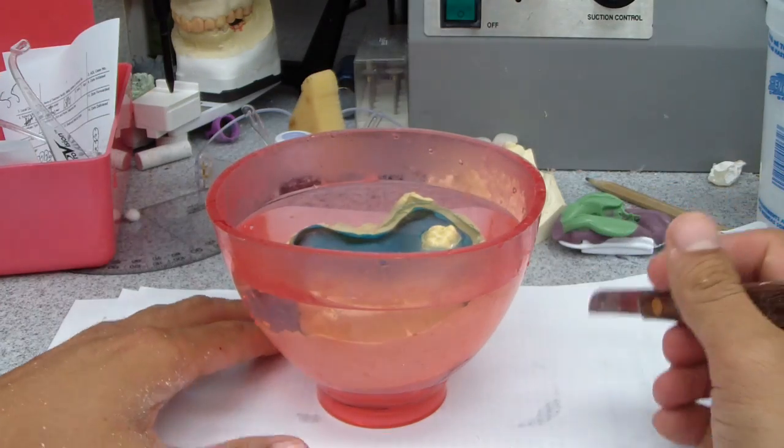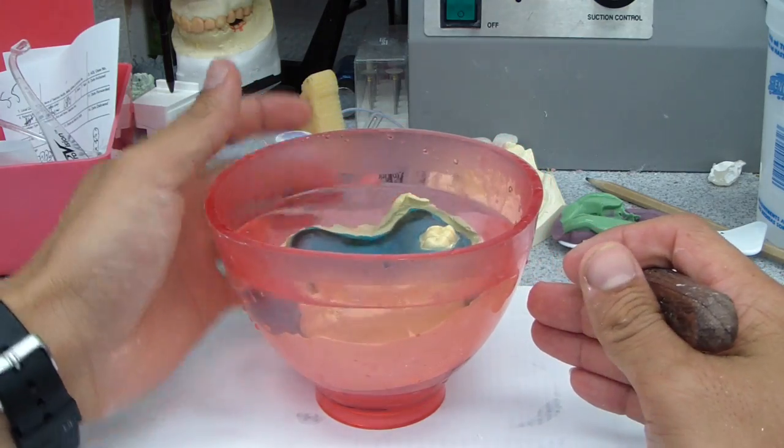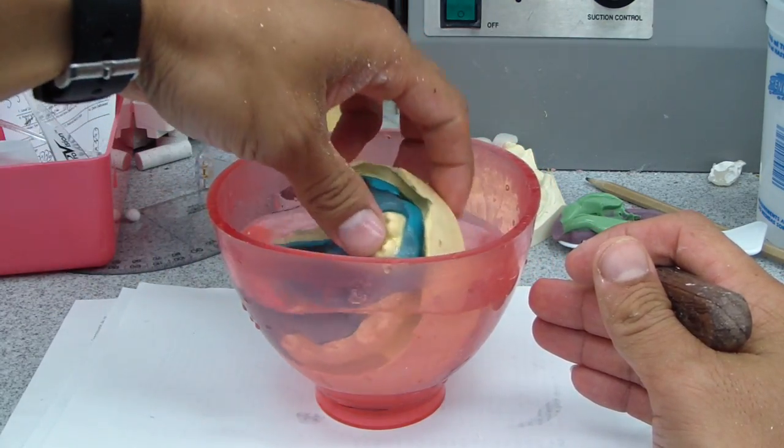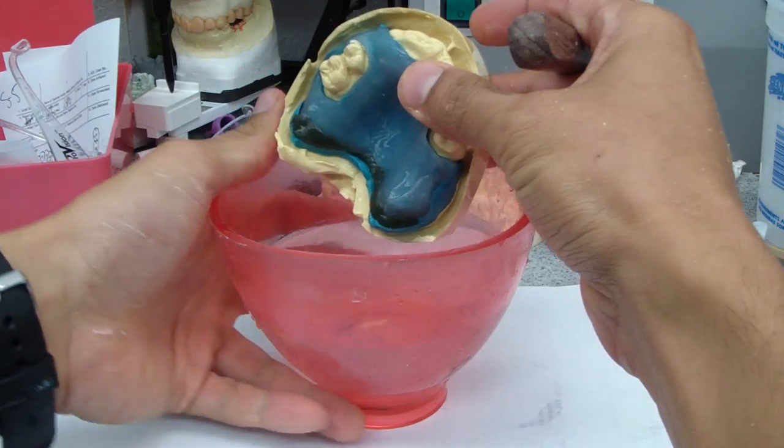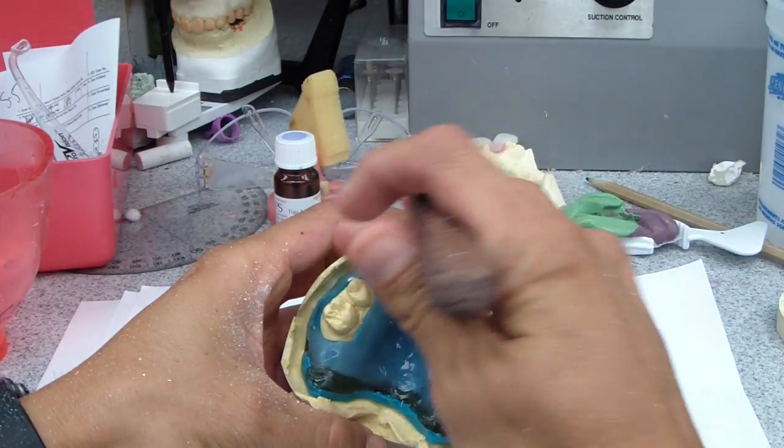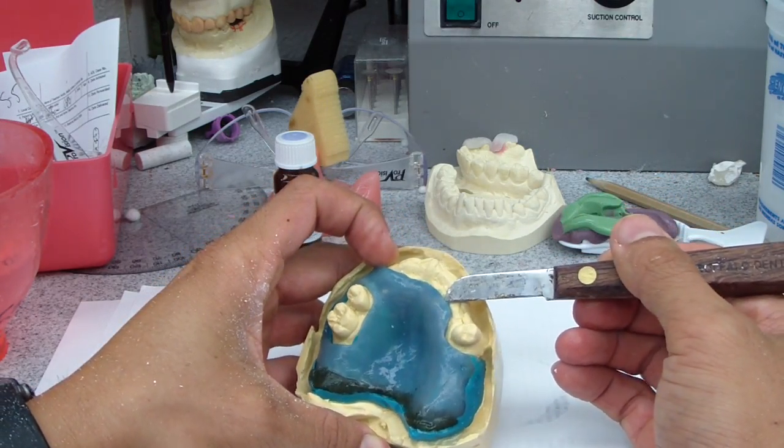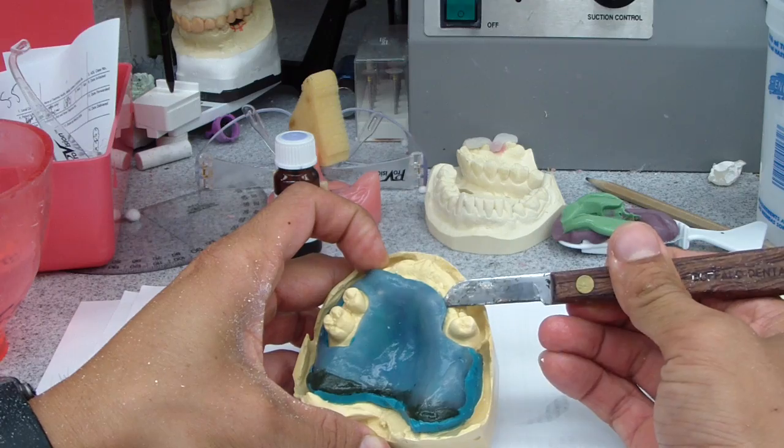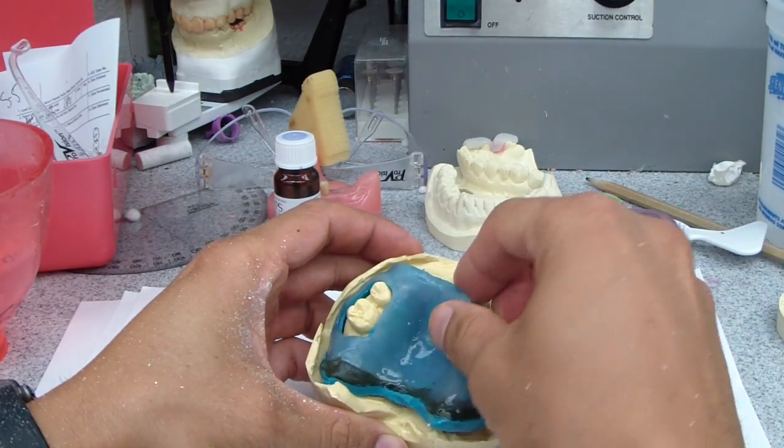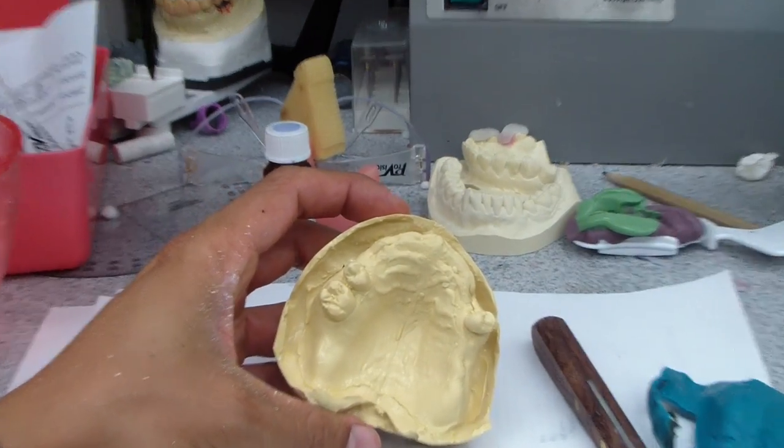Okay, so here we are. I just placed a bowl full of water in the microwave, and we're just going to heat up the border mold in the compound. And so we remove the alginate impression, and now I'm just using the heat to melt up the compression compound. And we'll remove that, just so we don't fracture the cast. And there's our impression.